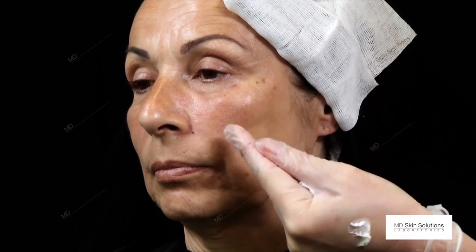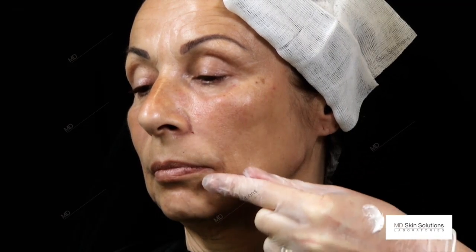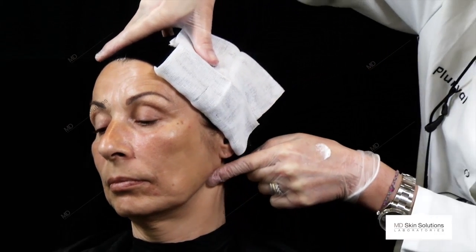We rejuvenated this lady's face by giving her a lateral lift, more of a frontal projection, a raising of the shade in the alar groove, redefinition of the corner of the mouth, smoothing out of the prejowl sulcus, and strengthening of the jawline.